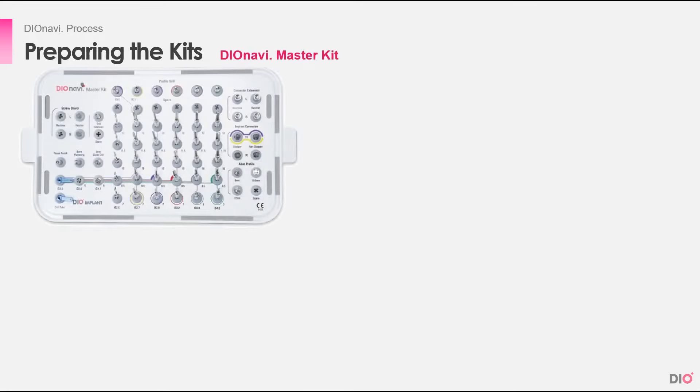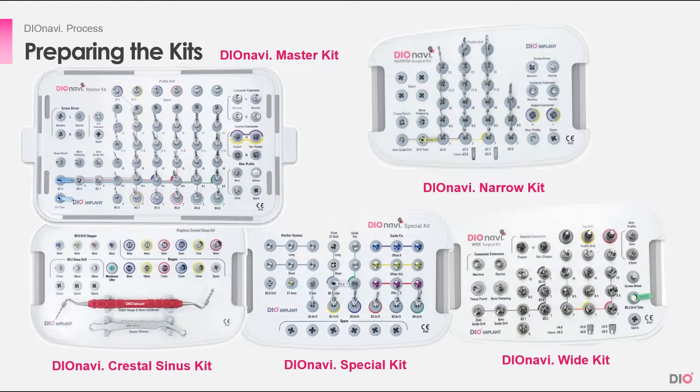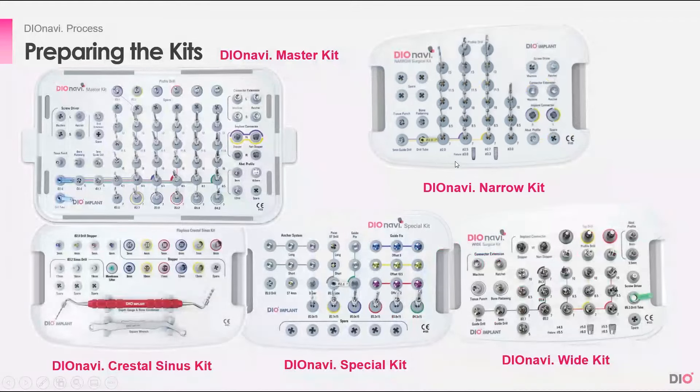After that, you must prepare the kits. There are several DioNavi kits: the DioNavi Master Kit, Narrow Kit, Sinus Kit, Special Kit, and Wide Kit. These kits are used in different situations. The Narrow Kit is used when placing narrow implants. The Crestal Sinus Kit is used when placing implants in a sinus location. The DioNavi Special Kit is used when placing full arch implants with guide pins and fixed pins to hold the guide. The Wide Kit is used to place wide implants. But the basic kit you'll be using is the DioNavi Master Kit.